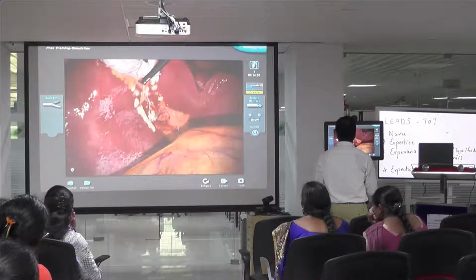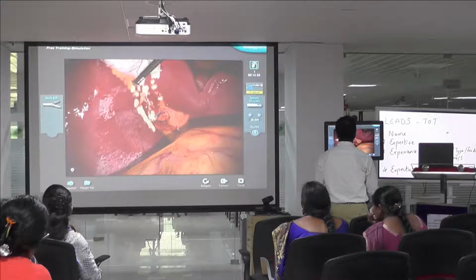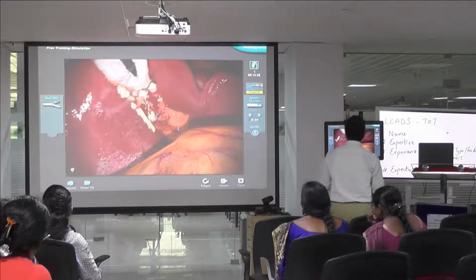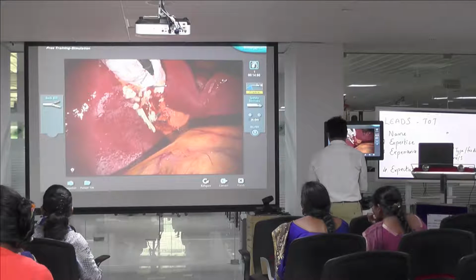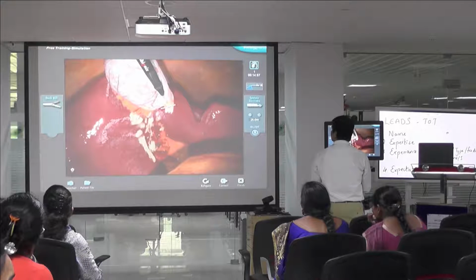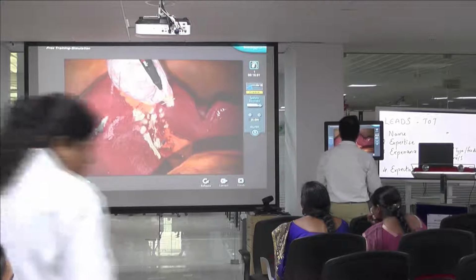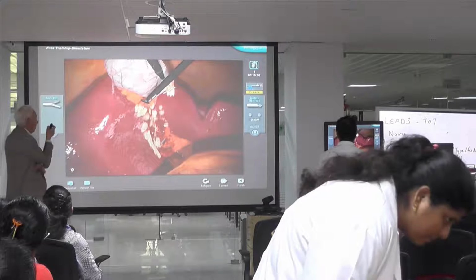If you use a hook, it has a small surface and it tends more to cut into the tissue. So again, the choice would be to use the spatula, and the spatula can also be used for blunt pushing off, and sometimes it's easy to push the gallbladder off the gallbladder bed if it is not fibrotic or inflamed. Okay?